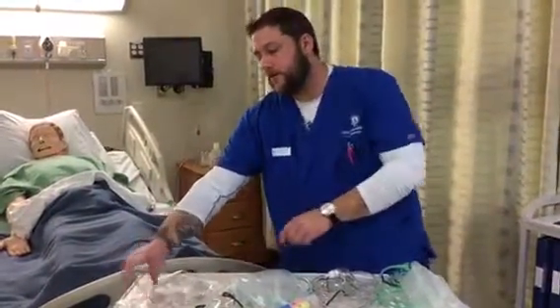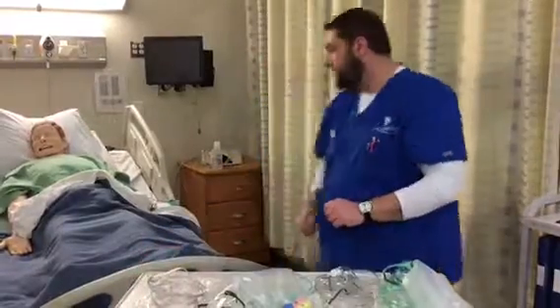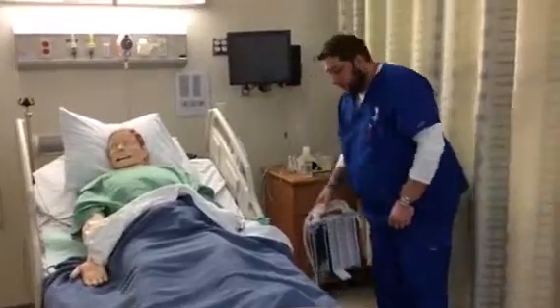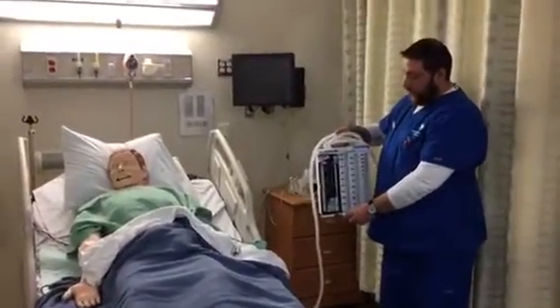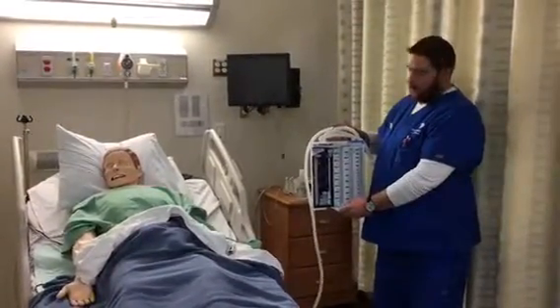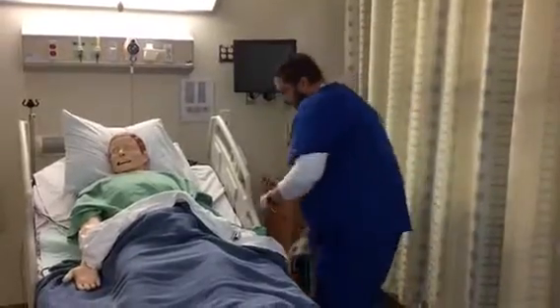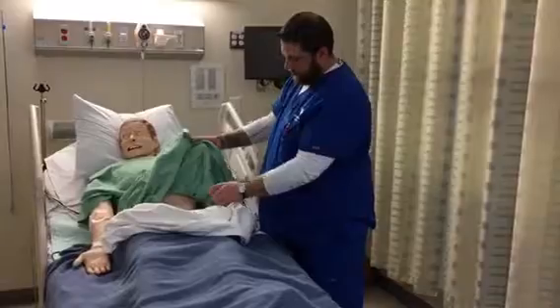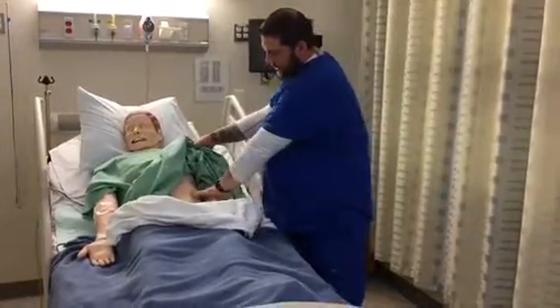Next, we have our closed chest drainage system. We're going to be dealing with the wet system. So there is a wet and dry. Most commonly used is the wet. This is used for anybody that needs drainage of the chest. As you can see, it's inserted in there.